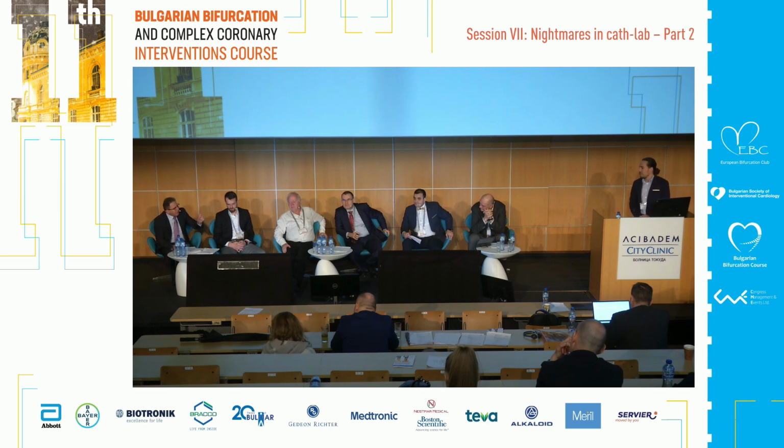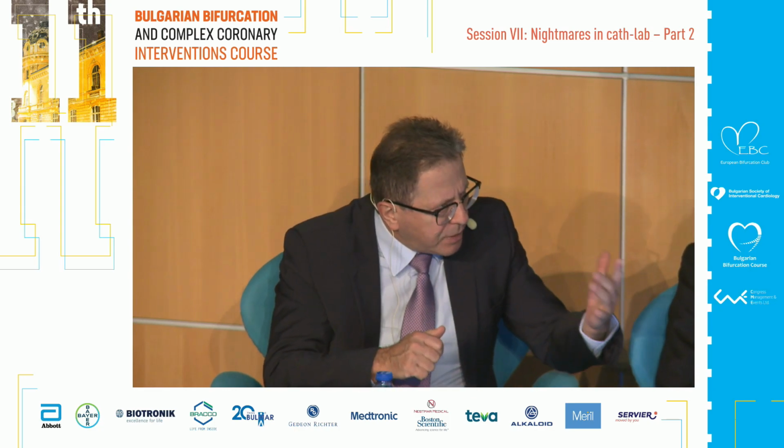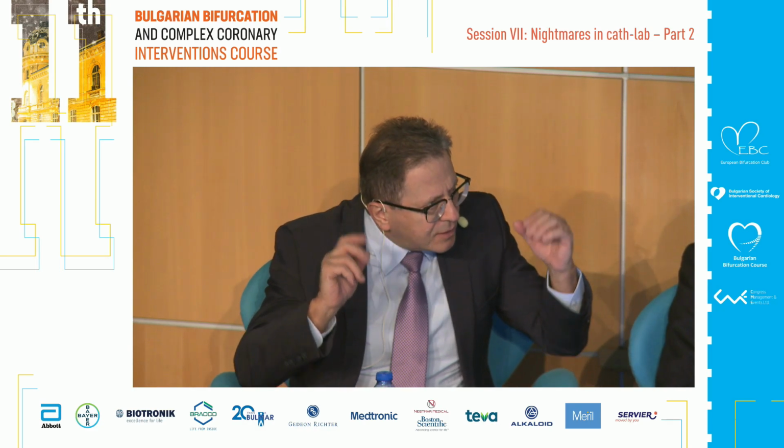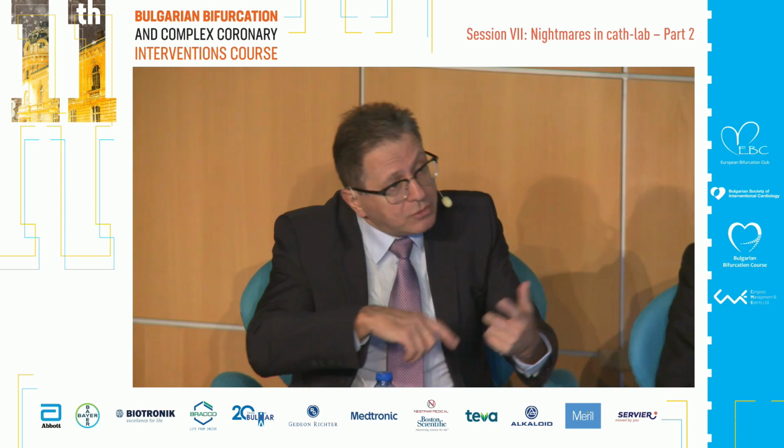But the question is, how did you measure the proper size? How could you be sure that the device used by you will fit? So you use ultrasonography diagnosis, or you use CT. So tell us something more. How can you manage this, let's say, translate this idea into practical work?